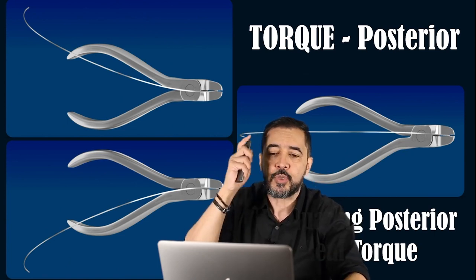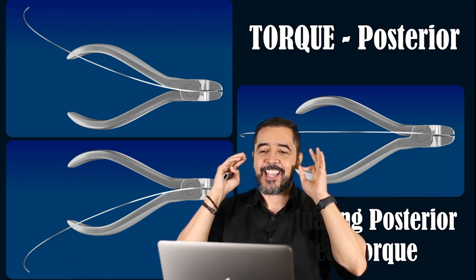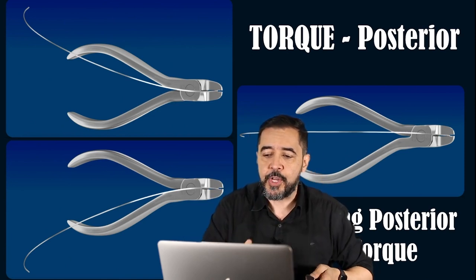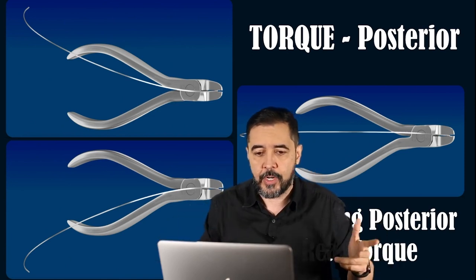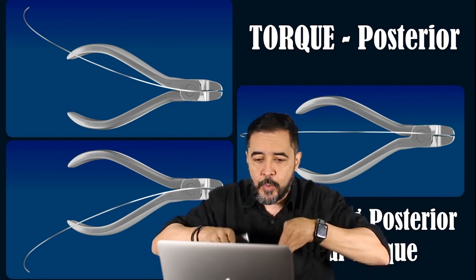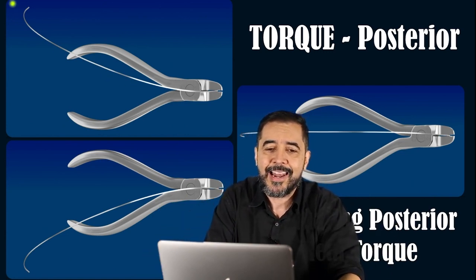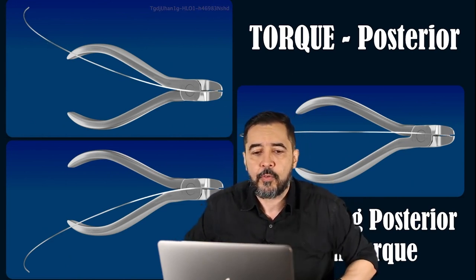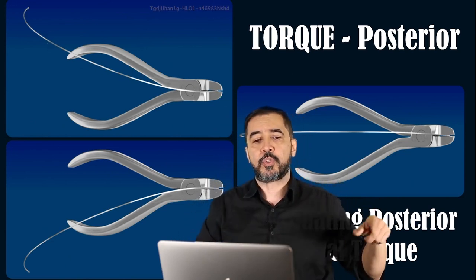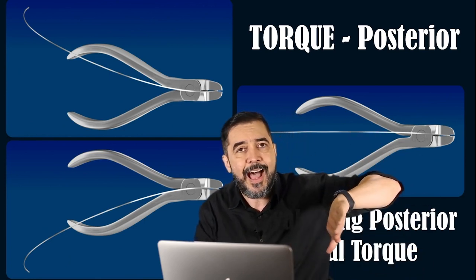So this is the real torque, and this is the evaluation of the posterior real torque, the posterior arch segment real torque, or the real torsion of the rectangular arch wire. When I grab the posterior part of the arch wire, the opposite tip goes up.